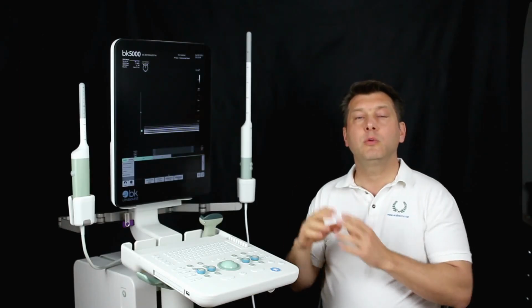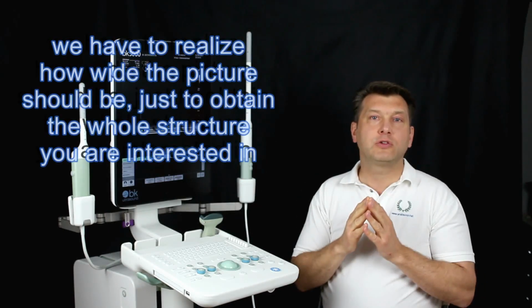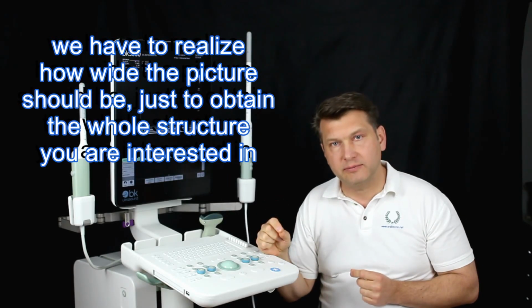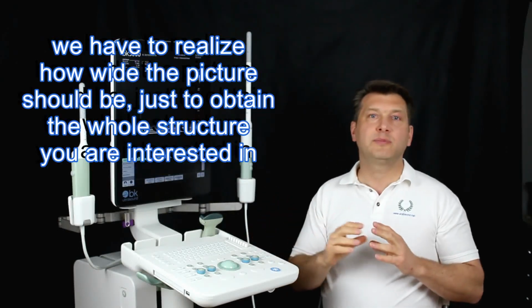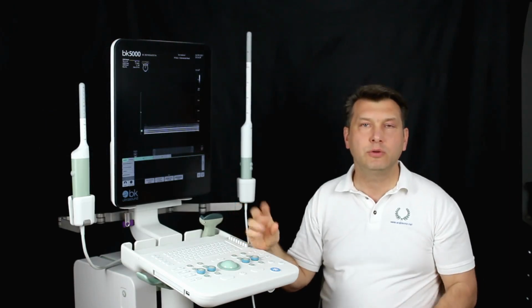The same goes for width. Here we have to realize how wide the picture should be, just to obtain the whole structure you are interested in. This happens similar to depth settings and is in this scanner already done. These parameters have to be modified when changing from detailed to overview recordings.